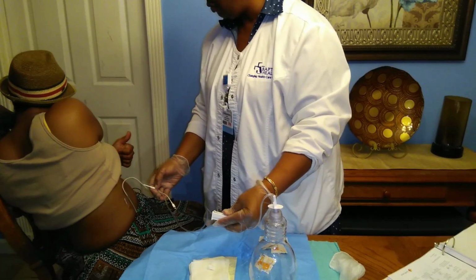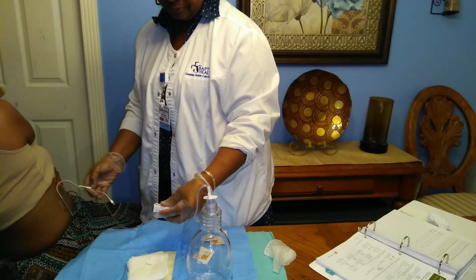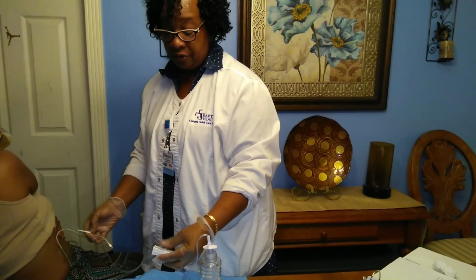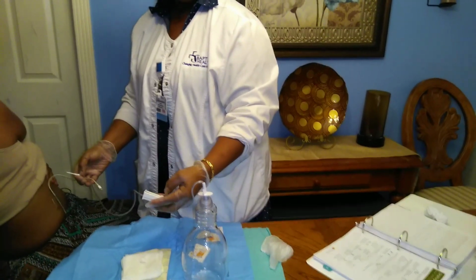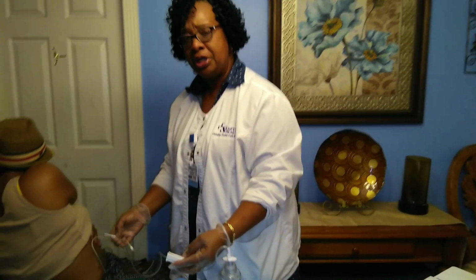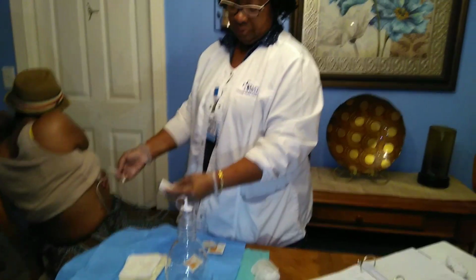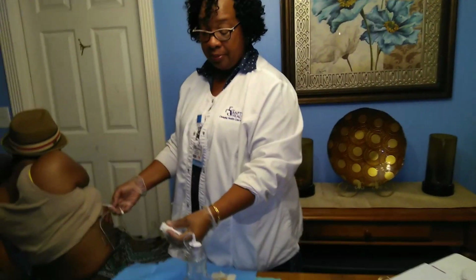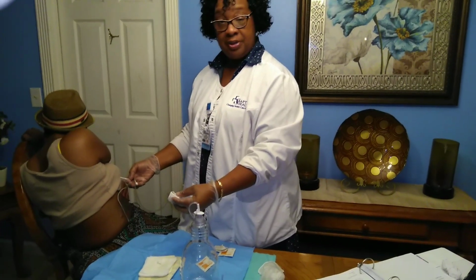Making sure the patient, are you okay? I always double check with my patient to make sure they're okay, and you'll see it starts to drain. Now, if this patient starts complaining of some discomfort, I will stop it immediately. Okay? If for some reason they've been getting back about 300, maybe 500 mLs of fluid or even more, today it's draining an awful lot. So if they can tolerate it, I open it back up again. Just keep it in mind that I can only take off 1,000 if it's up in the chest.